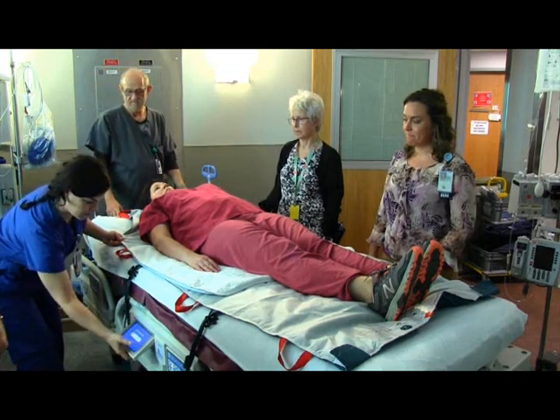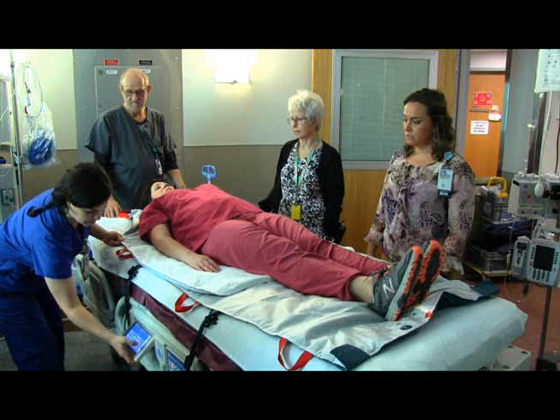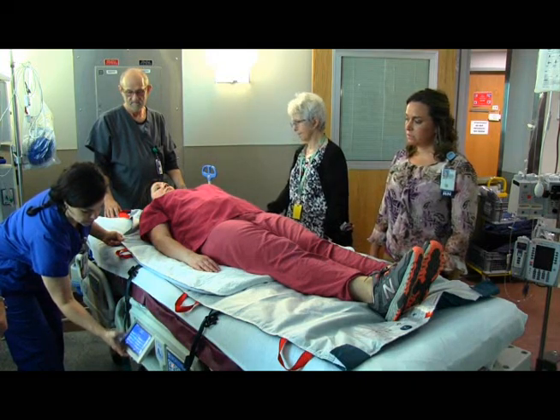This video is intended to demonstrate prone in place using an air-assisted device. Please follow facility policy and guidelines for proning in place for critically ill patients.